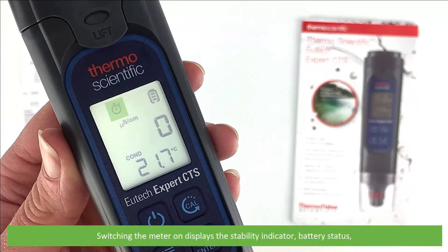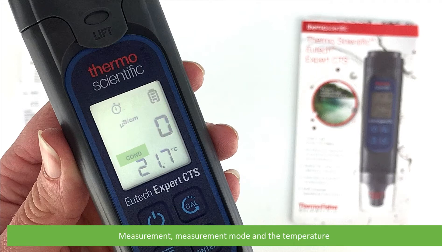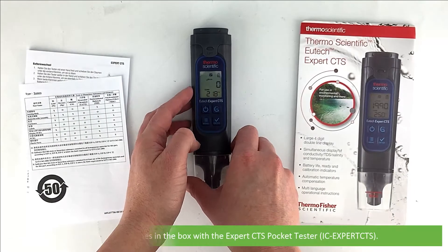Switching the meter on displays the stability indicator, battery status, measurement, measurement mode and the temperature. And that's what comes in the box with the Expert CTS Pocket Tester.